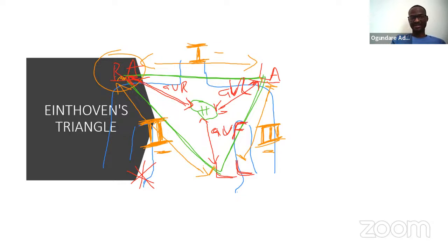So if you look at this all together, take your eyes away from the electrodes now. We generated all this with just 3 electrodes: the right arm, left arm, and left leg. Okay. But like I told you, when you have your ECG report, you are not going to be seeing right arm, left leg on the paper.